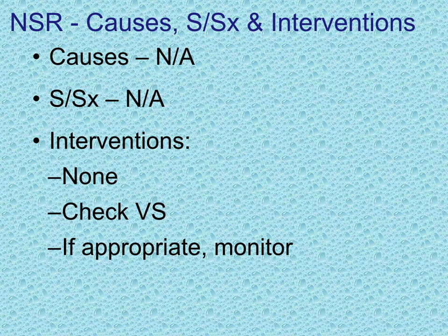Throughout the presentations, we will talk about causes and signs and symptoms and interventions of these rhythms. This will be important if you're going forward to ACLS or if you're working in a clinical area where some of the signs might be significant and some of the treatments may be very standardized. This is not always part of recognizing a dysrhythmia, but it's very good information for you to have. And again, if you're going forward for other parts, this is very, very important. For sinus rhythm, of course, there's no cause, there's no signs and symptoms, there's no interventions. We're always going to monitor our patient to be sure that they can tolerate the rhythms that they're in.